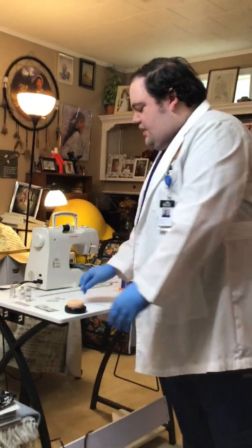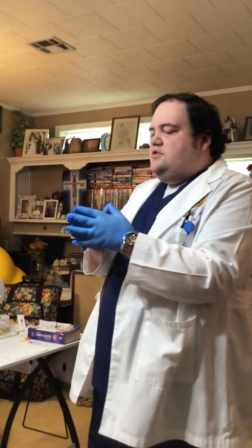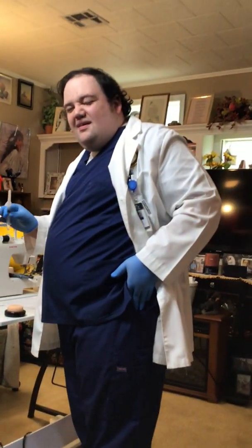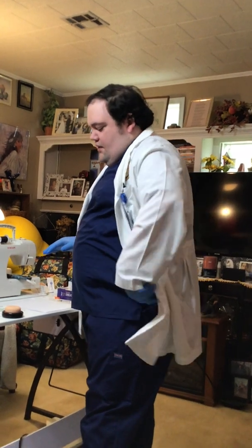But the Z-track method, in this case, is an intramuscular shot, so this is going to a muscle. I'm going to use the example of the ventral gluteal site, right here in the hip. There tends to be less fat right here than back here, which is the dorsal gluteal. So I have a better chance of getting into the muscle right here. This drug tends to stain, so we're going to give it what's called a Z-track. When I do it on this pad, assume that it's this part of the anatomy.